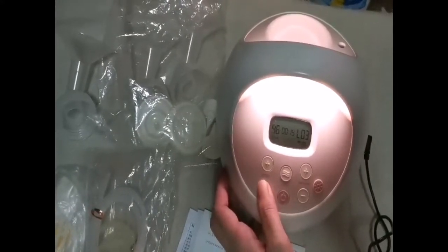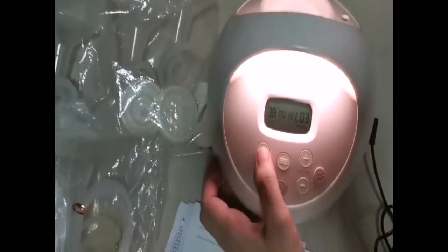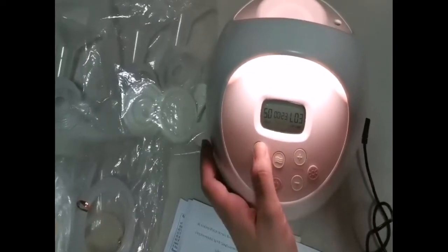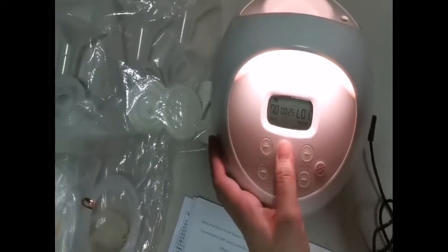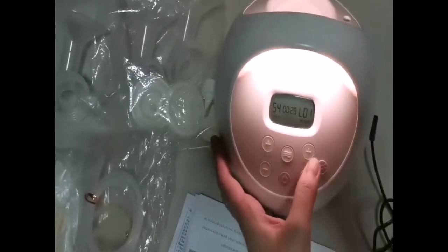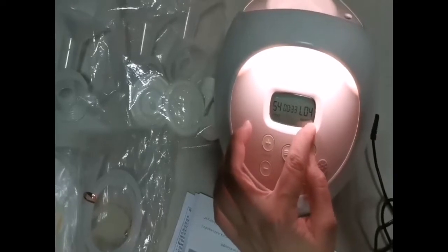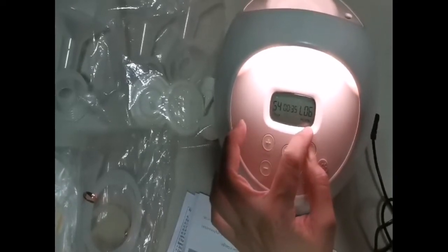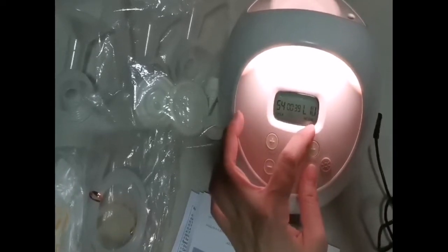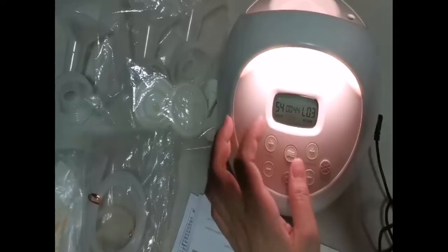Especially if your baby is sleeping, you don't need to turn on the lights. You just need the breast pump light, and you can adjust it. You can also adjust the massage settings and the expression settings — you can go higher or lower, or normal — and you can change it to different level settings.